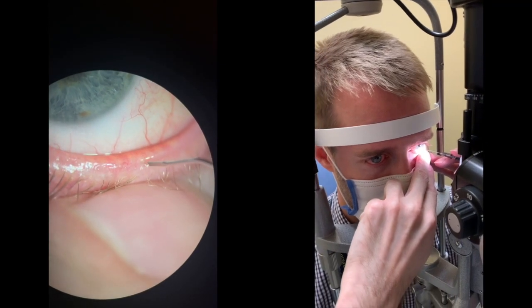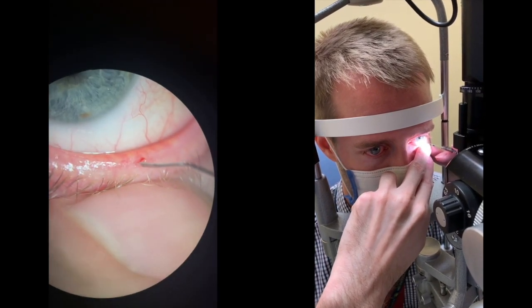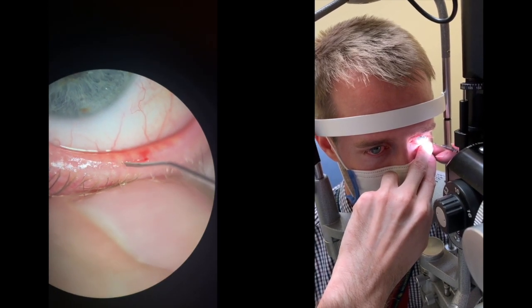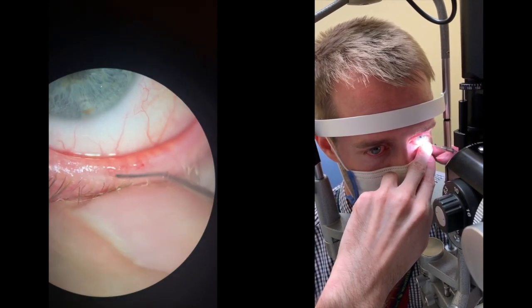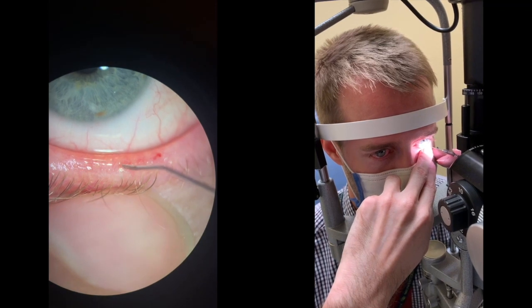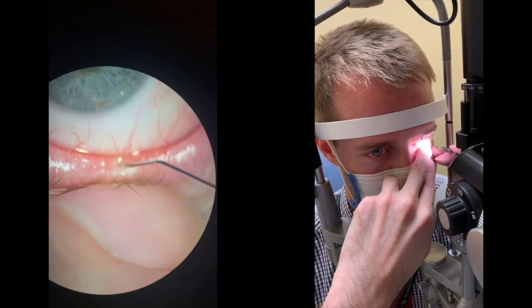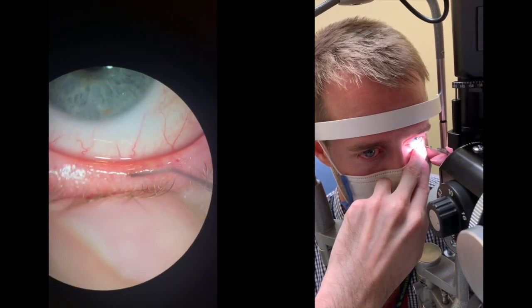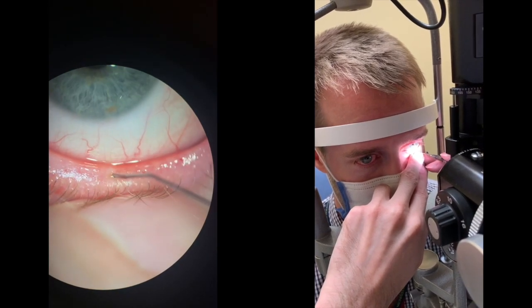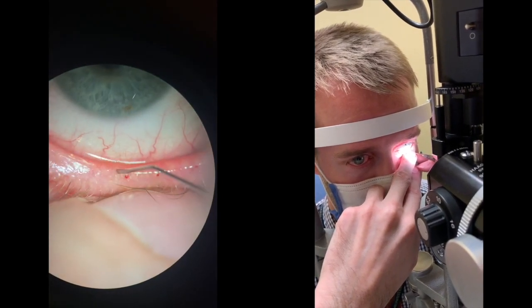It is very common to see some bleeding, and the white structures that you see in the lid are the glands. The opening to the glands is right in between those two structures. Usually you see small little dots that show you the lumen of the meibomian glands. Sometimes trying to express can help initially to locate some of the meibomian gland orifices, however this is not always possible, and if there's no indication of where the opening is I have not been able to successfully probe them.